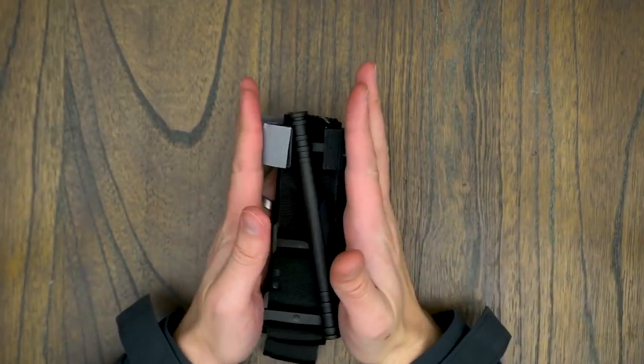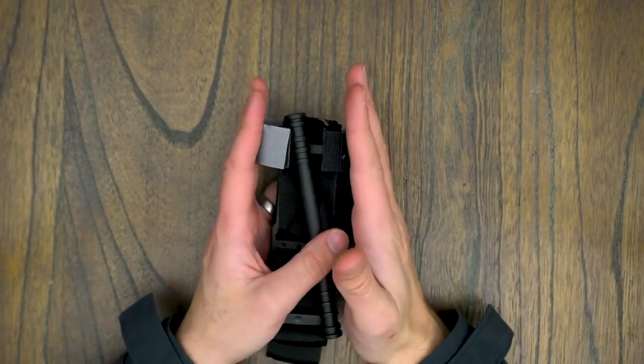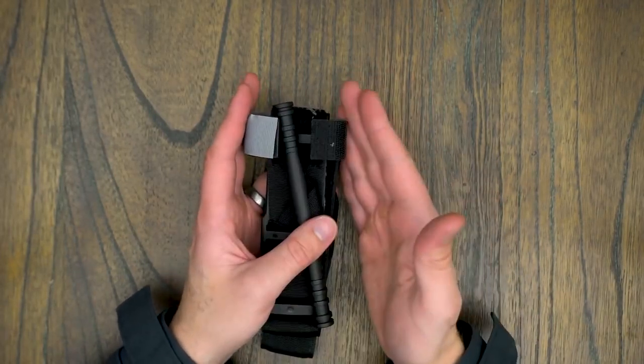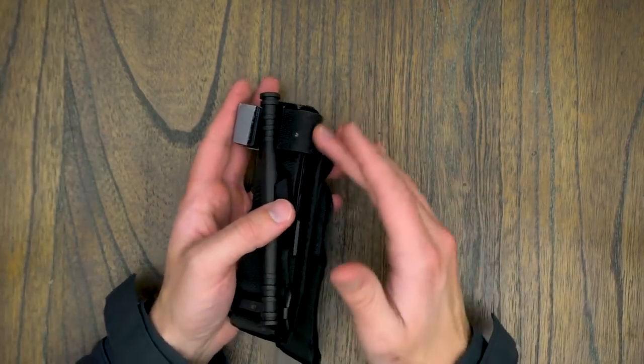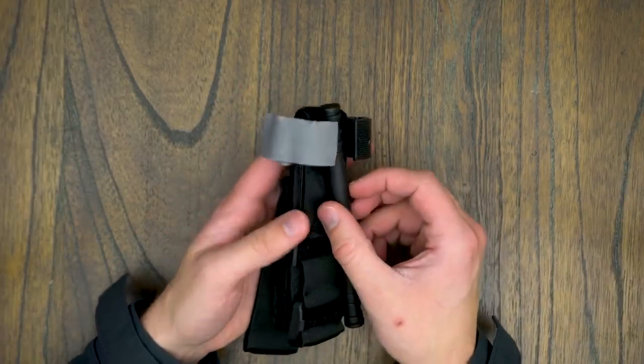A lot of companies are making tourniquet holders that actually keep this Velcro from tearing at your uniform. There are little shirt savers on the side, so you don't have to worry about this hard Velcro destroying your uniform or rubbing against your skin.